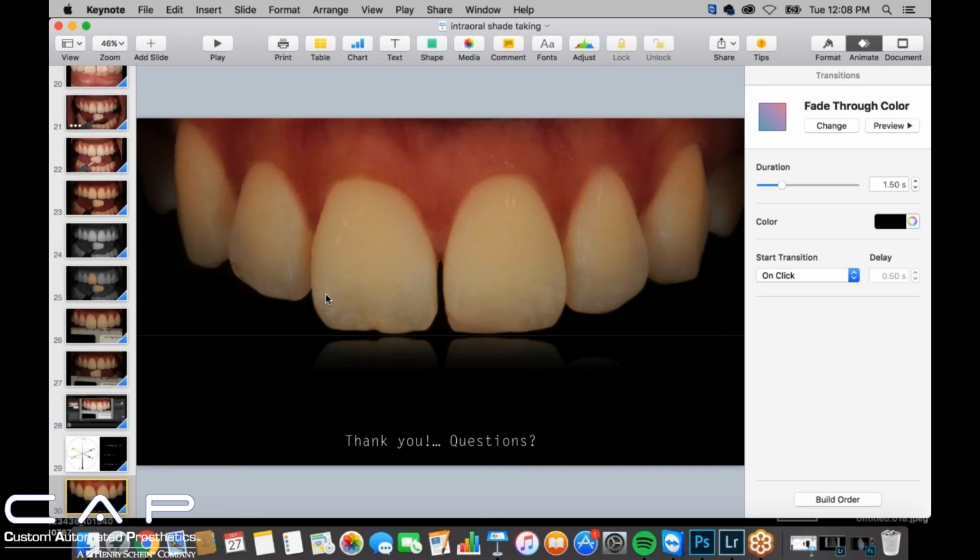It's not necessarily showing me what shade I need to use. It's exposing everything that you can't see with a standard reflective photograph, because you lose a lot of the detail in those. So I went ahead and bought the same filter kit for my lab, and when I have patients come to see me, I use that as well.